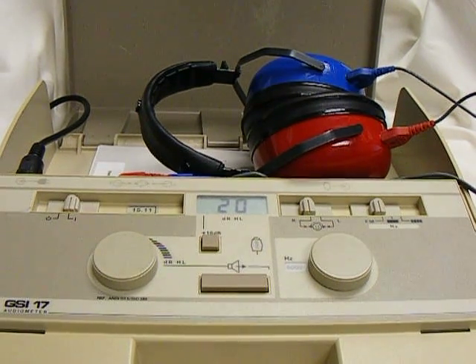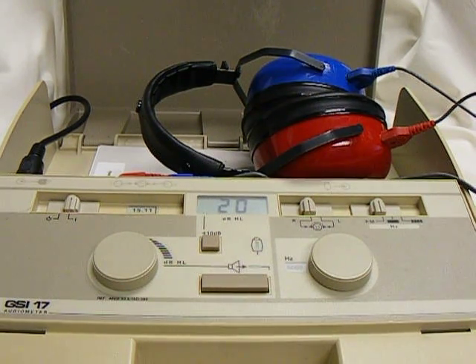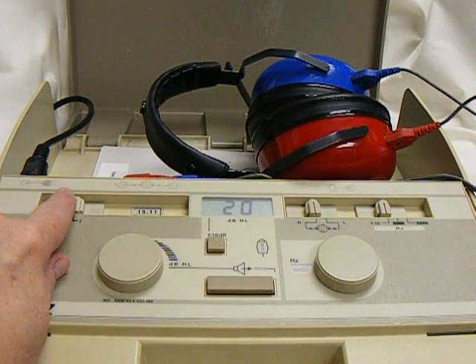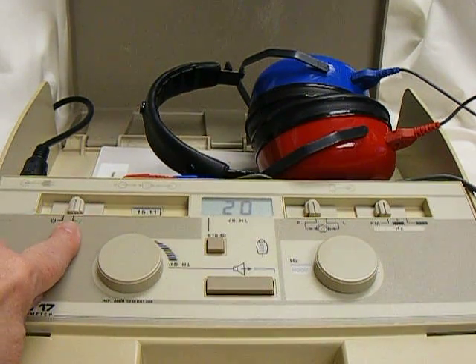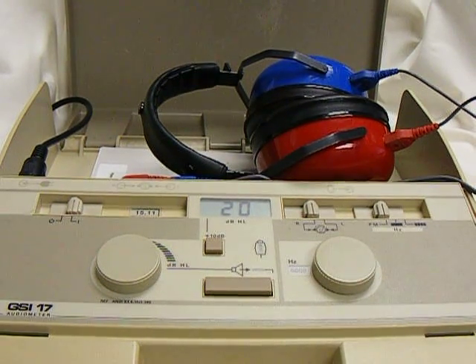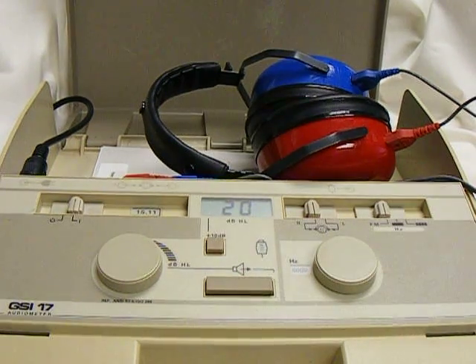Hello. This is the GSI 17 audiometer and I'd like to give you an update on how to use it. In the morning, this is where you would turn it on. I is on and the O with the little dash is off. You can see the number in the display and that tells you that the audiometer is on.